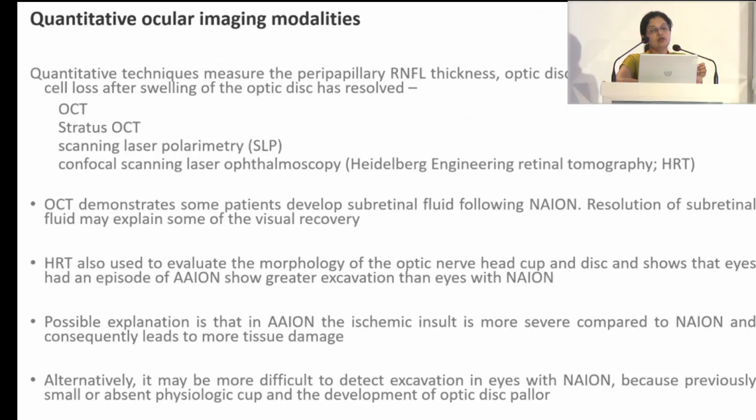And quantitative ocular imaging like stratus OCT, scanning laser polarimetry, and confocal scanning laser ophthalmoscopy are also used to quantitatively measure the peripapillary RNFL thickness, optic disc morphology, and ganglion cell loss after swelling of the optic disc has resolved. And HRT, that is confocal scanning, is used to evaluate the excavation of the optic nerve after an episode of AION.